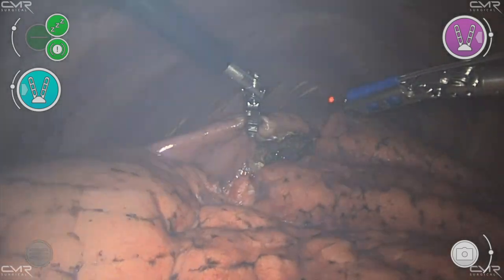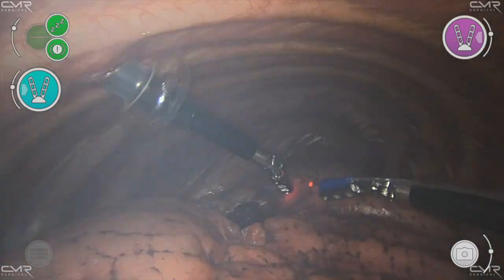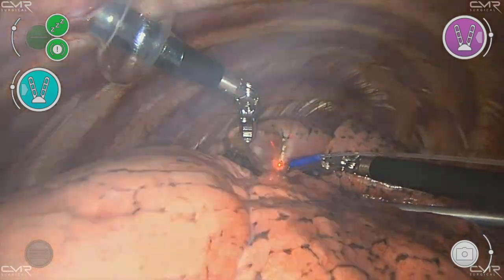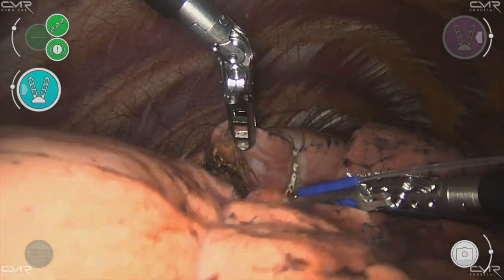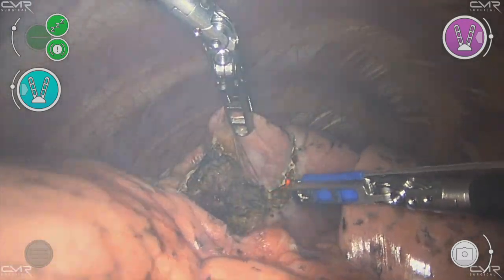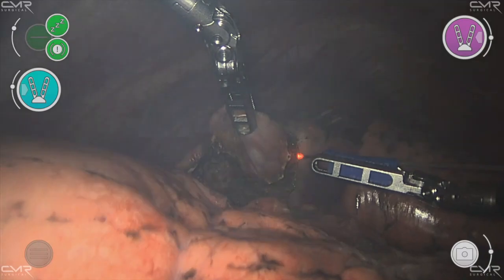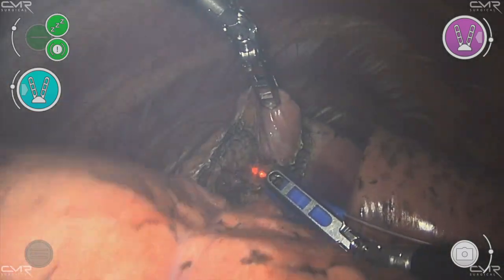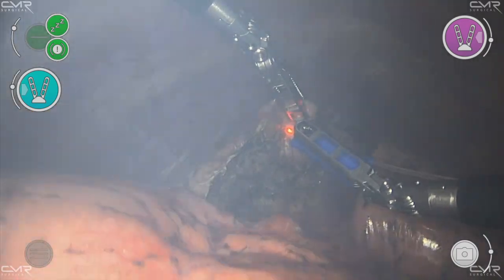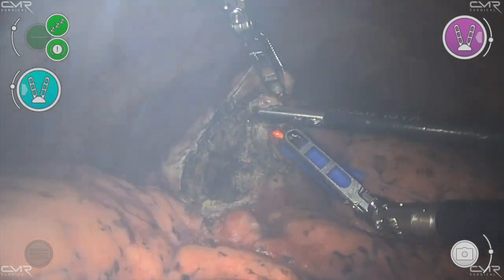It's really a very lovely way to do nodules, especially for peripheral nodules and nodules against the pleura. It has a nice panned back view so you get a good view of the chest. We just got rid of some of the smoke and again he's just curving around the higher of the two nodules. There are just two nodules here which were suspicious for renal metastases. The grasper has a nice good strength so it can lift up and we can get any angle we like to diathermy around it. This is in the upper lobe and then there is another one in the lower lobe. These will be quite small so we're not going to need a larger incision to remove them - we really are just going to be sticking to very small 5mm ports with one 10mm port.